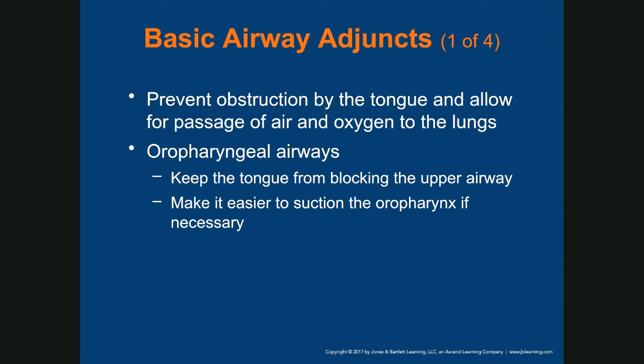The OPA, or oropharyngeal airway, is indicated when you have a patient that is unresponsive, with no gag reflex, meaning vomiting reflex, and a ventilation problem. I'm going to repeat that. The OPA is indicated when you have a patient that is unresponsive, no gag reflex, and a ventilation problem.